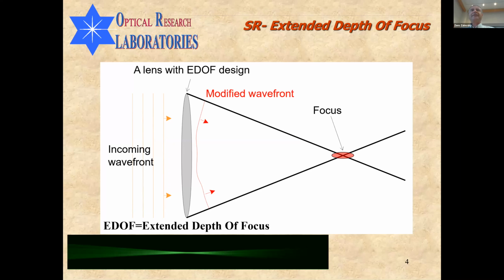So we don't have diffraction orders. All the energy flows on axis to the zero diffraction order, and therefore we have much less chromatic aberration and much higher energetic efficiency. Our scratches are larger. They are not in the order of the optical wavelength, but much larger, so there is no significant diffraction effect. What we do have is interference.